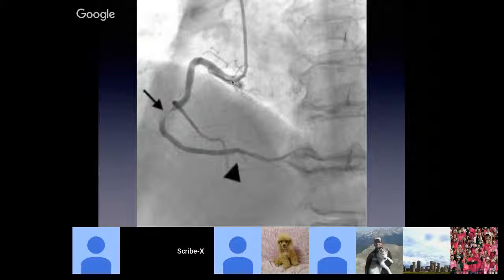She has squirted dye into the right coronary artery, and the dye is causing this black pattern here, and this is blood flow. So the dye is traveling along the vessels, and whoa, you can see that this area of the coronary artery is really tight and tiny. There's very little blood going through here, and it reconstitutes on the other side, so it's not all the way occluded.